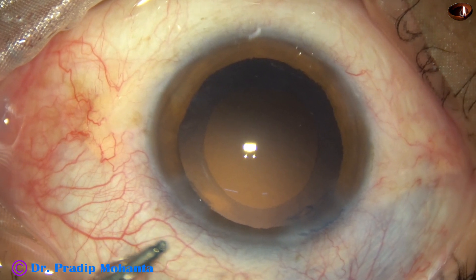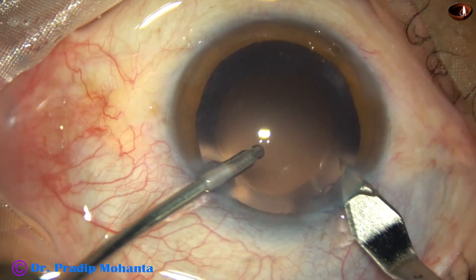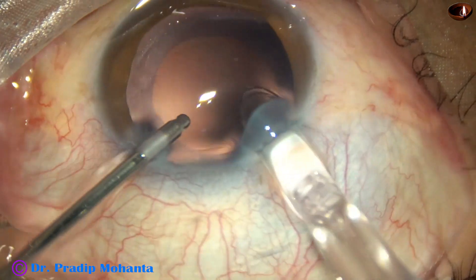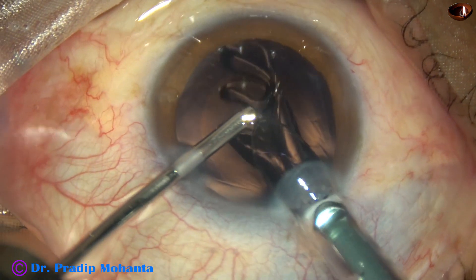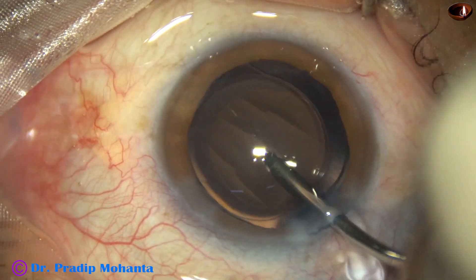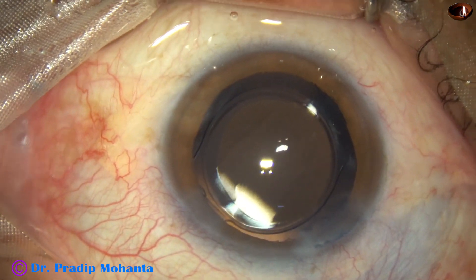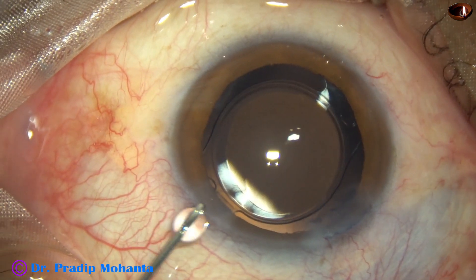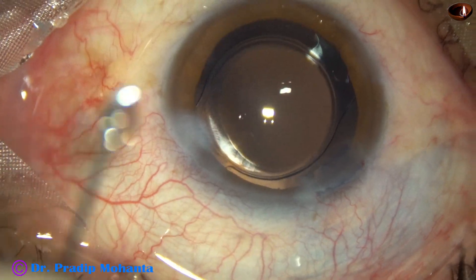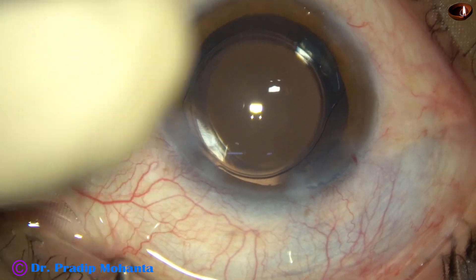Now is the time to implant an intraocular lens. I am going to use a B cartridge, so I enlarge the main wound a bit. Hydro-implantation of a single-piece monofocal aspheric intraocular lens is done. The lens has gone into the capsular bag. The lens is dialed by the irrigating probe. Since we have not used any viscoelastic for implantation, we have avoided the risk of visco-induced raised intraocular pressure.